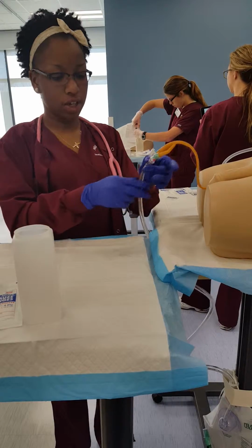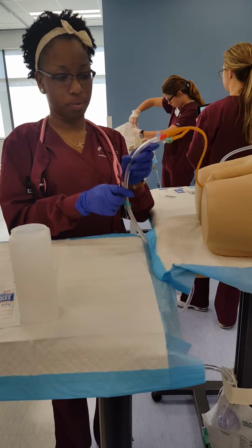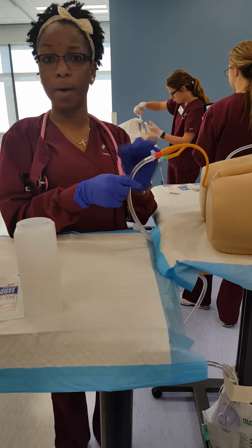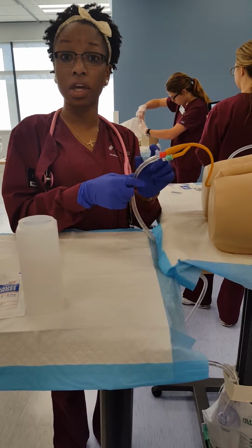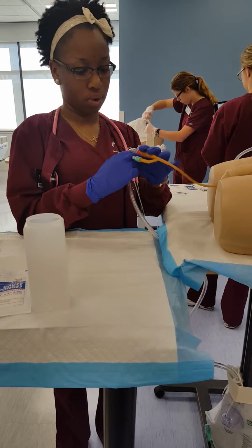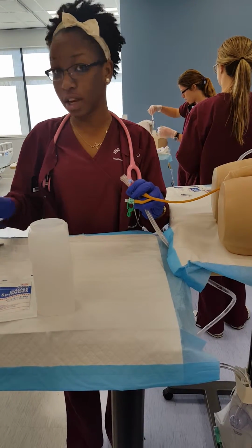For the medication, I am going to kink this part of the catheter. It's always better to kink it as close as you can to the port. Now, since I've touched this, I have to clean it again.